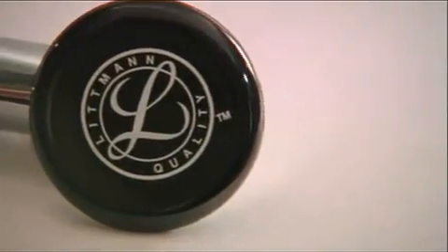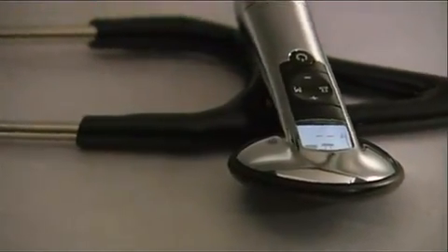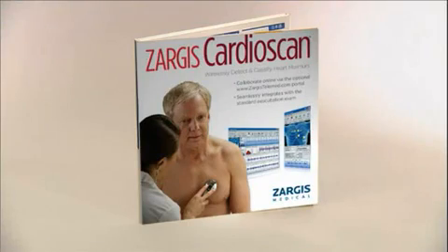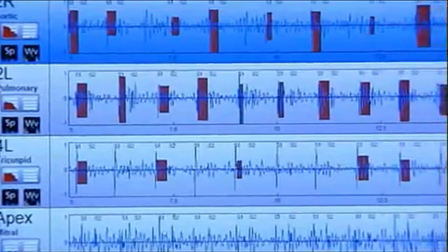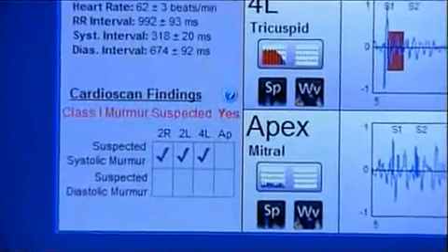The following is a demonstration of the 3M Littmann Model 3200 electronic stethoscope with Bluetooth technology and its companion Zargis CardioScan heart murmur detection software. With the Bluetooth technology built into the Littmann Model 3200 stethoscope, you are now able to wirelessly transfer and view sounds real-time as you auscultate your patient. With the Zargis CardioScan software, you can now detect suspected heart murmurs with a Class 1 indication for echocardiography referral.